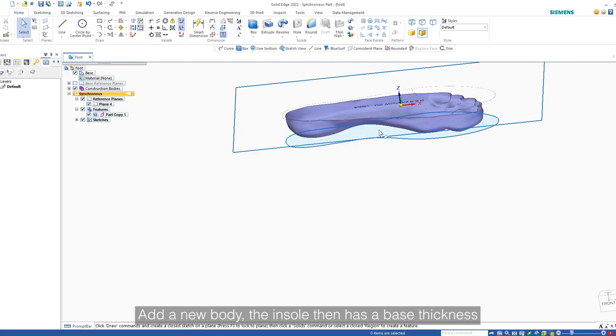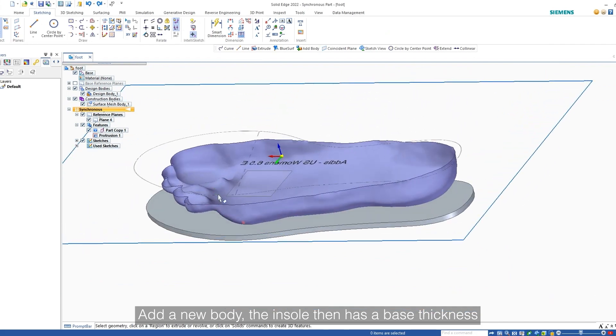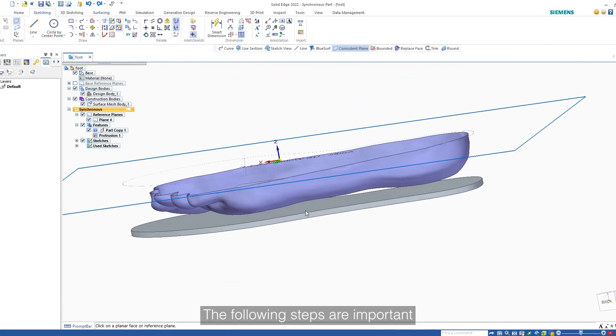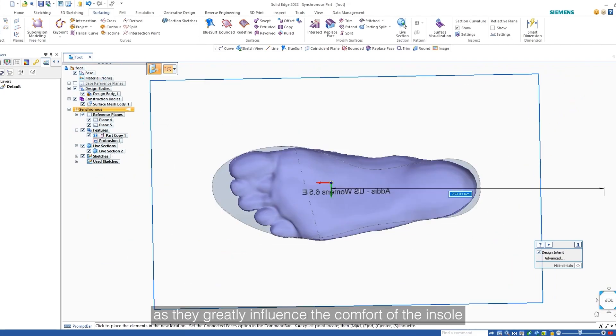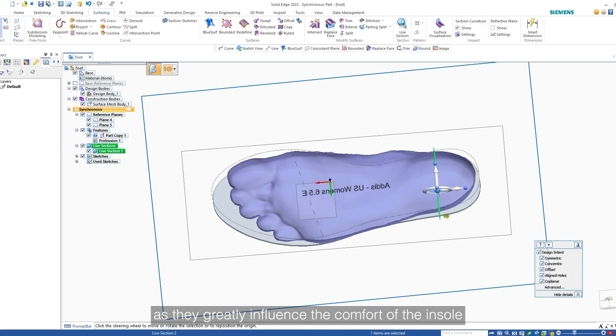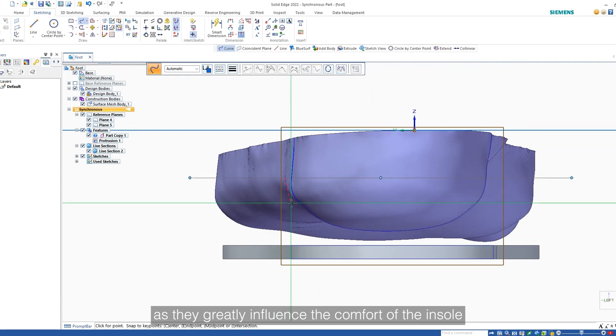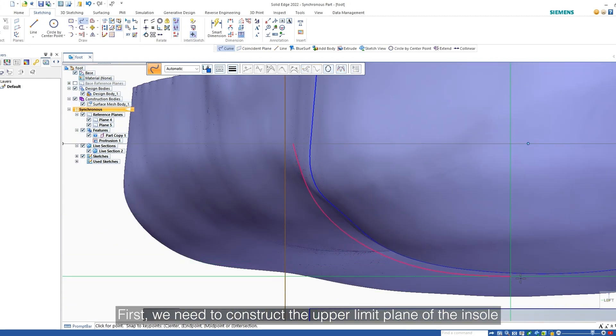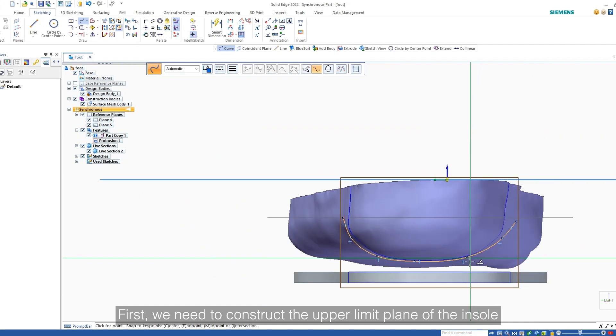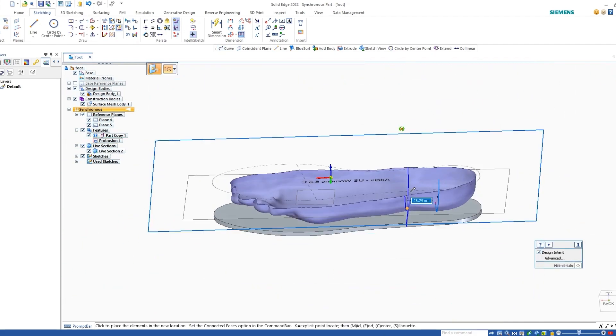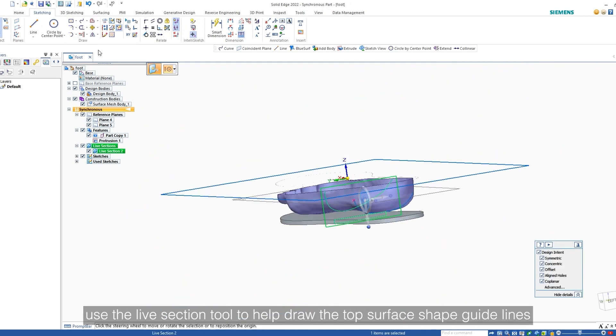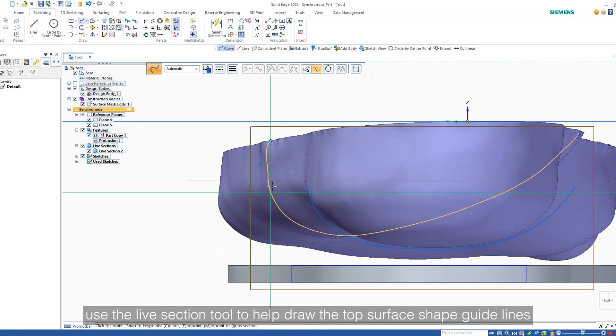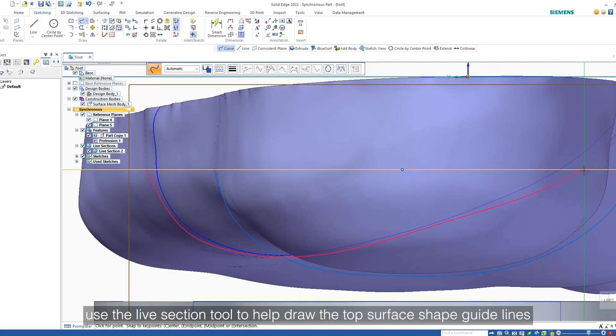Add a new body, the insole then has a base thickness. The following steps are important, as they greatly influence the comfort of the insole. First, we need to construct the upper limit plane of the insole. After that, use the live section tool to help draw the top surface shape guidelines.